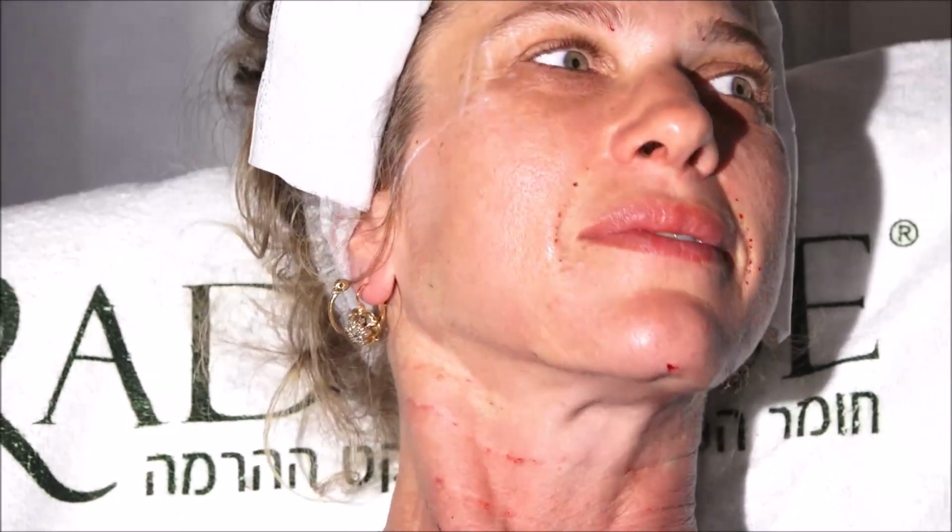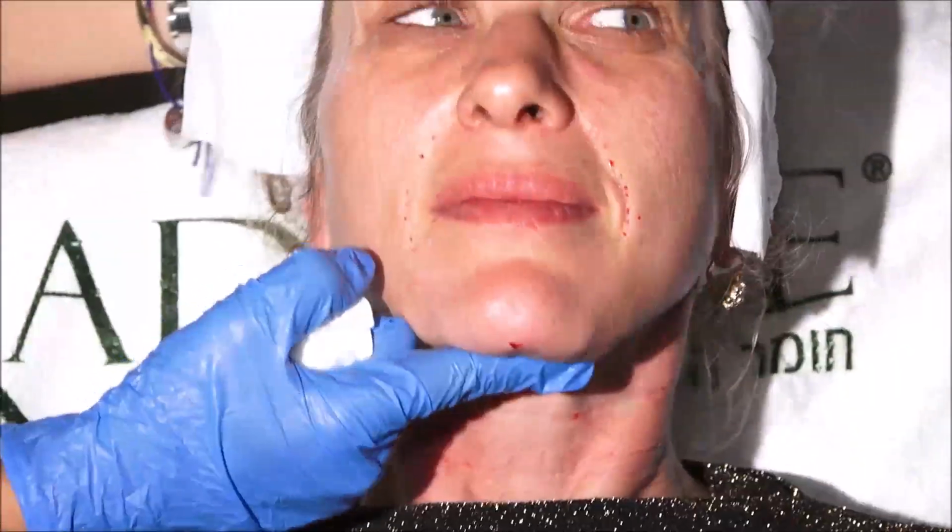I have brought it. The other side is faster. Yeah. Always when you're not explaining, right?